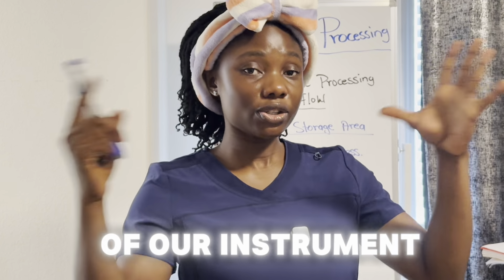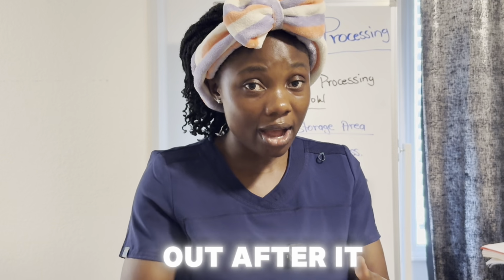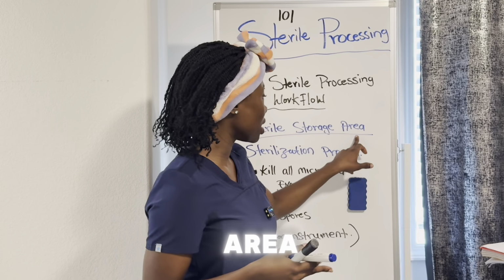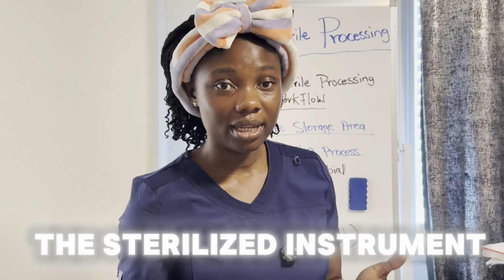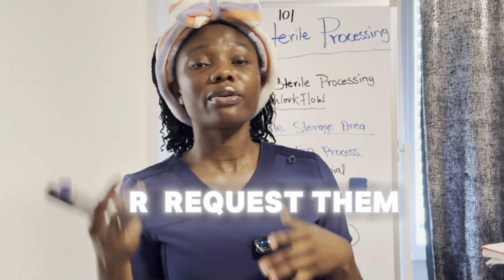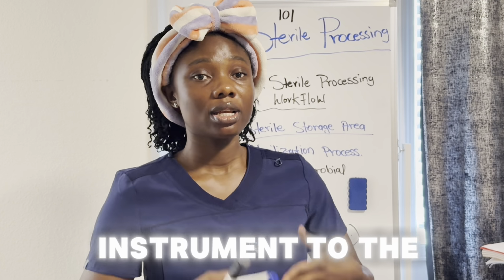So the storage area is where we keep all of our instruments that have gone through the sterilizer. We take them out after they cool down. We take them to the storage area. So the storage area is where we keep all the sterilized instruments, and they will be in there until the OR requests them, and then we can deliver the instruments to the OR.